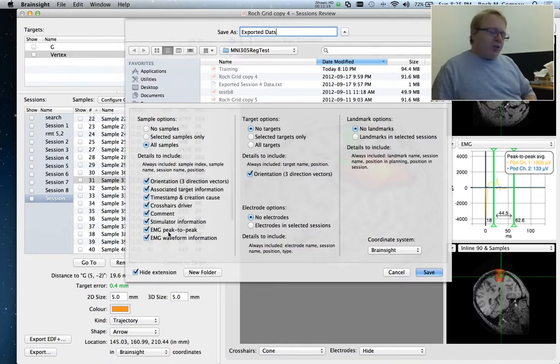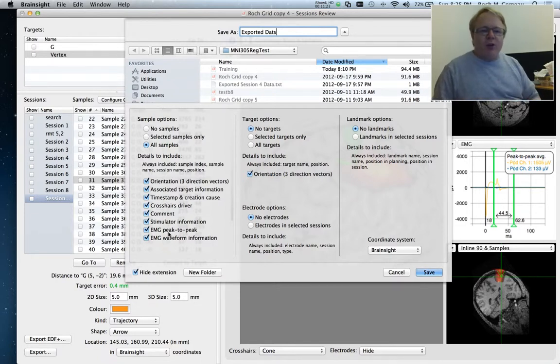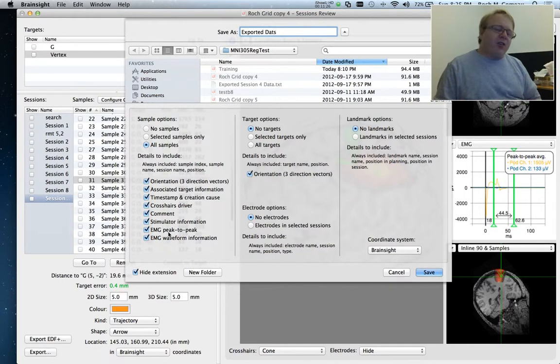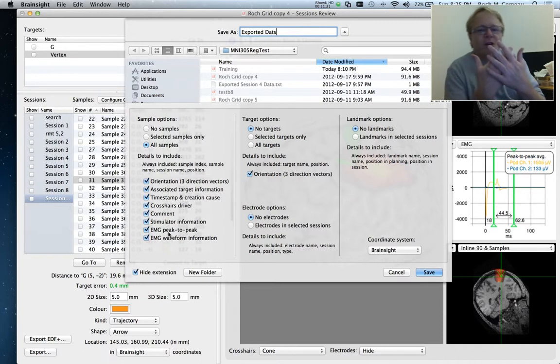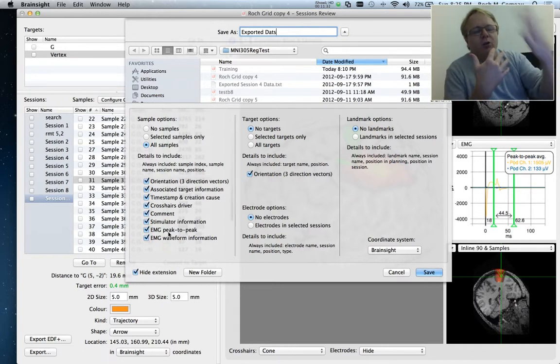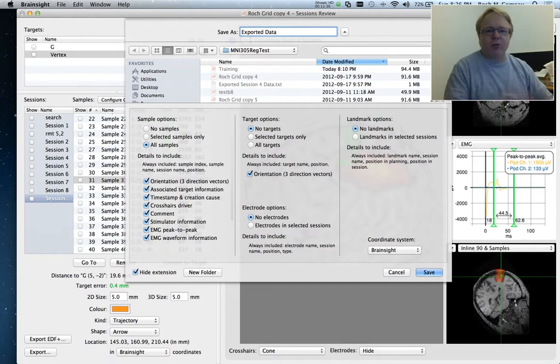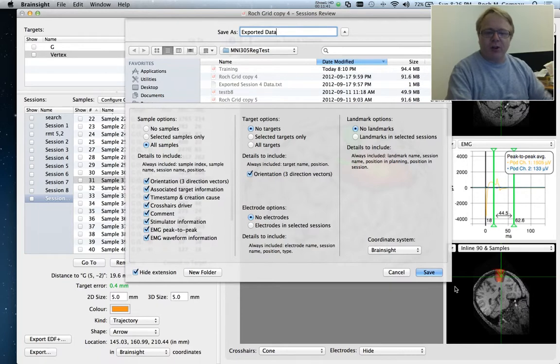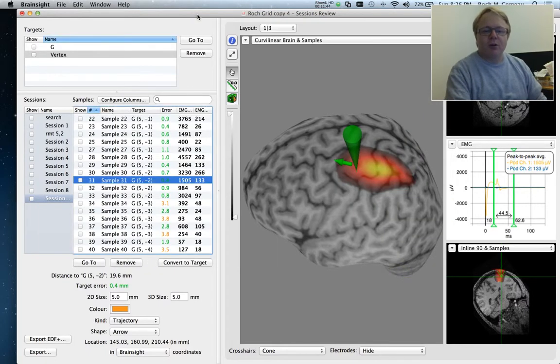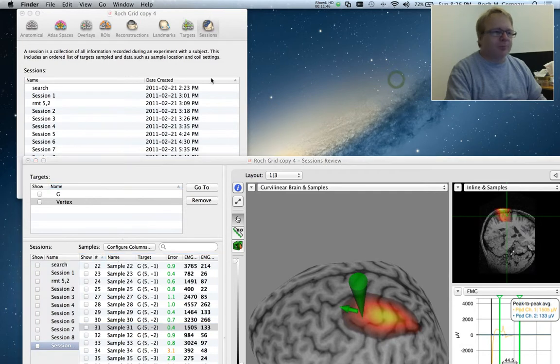So you can then, in some other program, MATLAB for example, load all the EMG waveforms and do some sort of post-processing. In fact, if you can re-export your processed data in the same file format, you can re-import that in BrainSight as a synthetic session. So then you can, side by side or overlay, show your raw data and any processed data at the same time. So you can use that for different types of visualization. We can also export the targets. And we can export the landmarks.